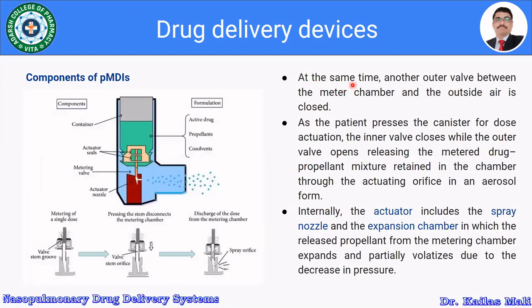At the same time, another outer valve between the metering chamber and the outside air is closed.